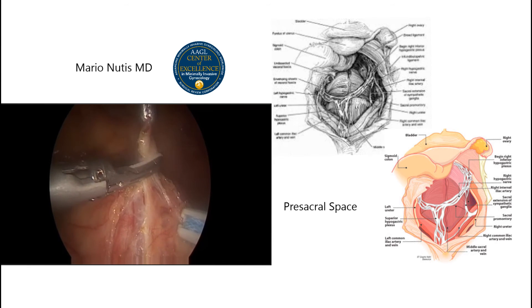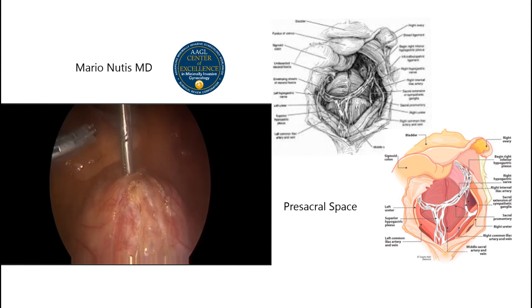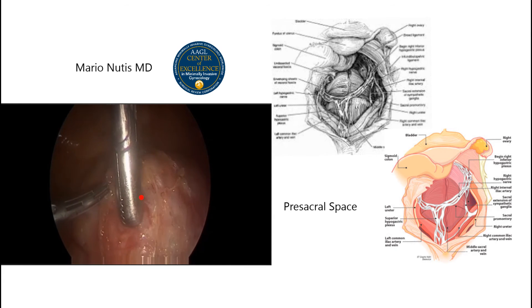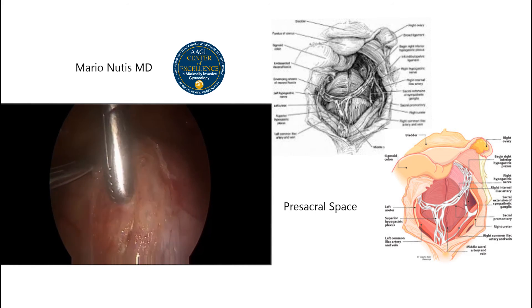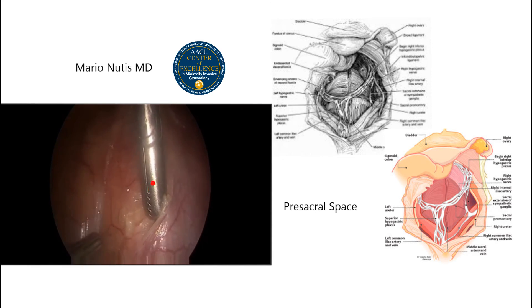This procedure is done outpatient. The patient, when recovering from anesthesia, can go home. Here you can see part of the hypogastric plexus, and here you start seeing the sacrum. The sacrum is right here, and fibers of the plexus are still there. The middle sacral vein and artery are right here.